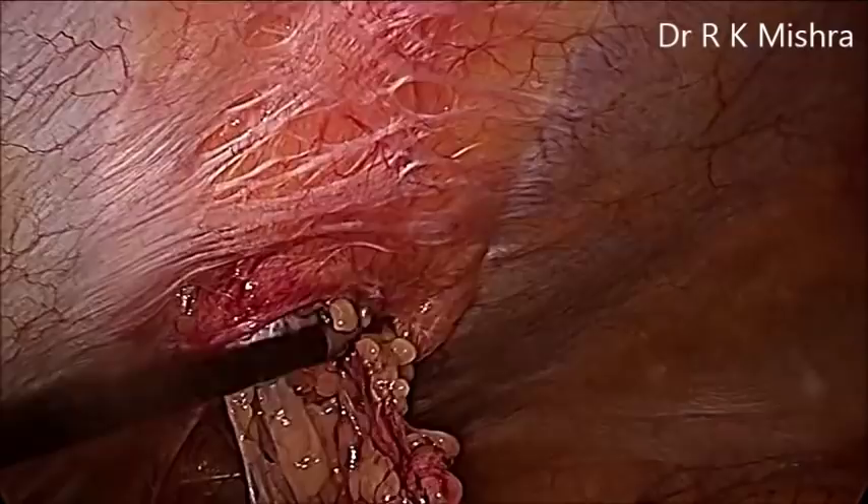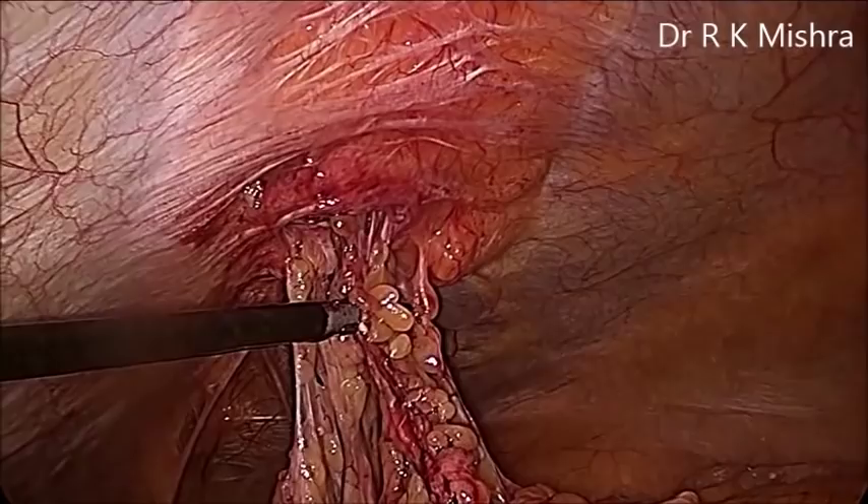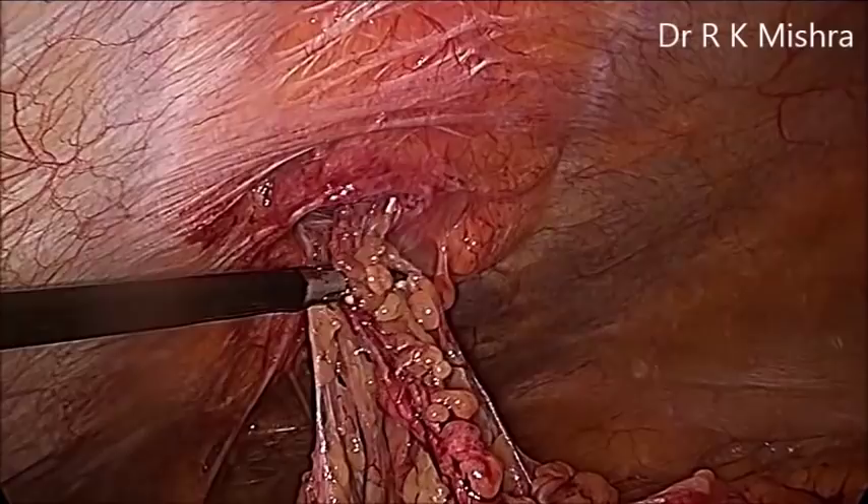This is the slow dissection and slowly the entire sac is separated. Sometimes it is so adhered that it will not come easily. In those situations, either you can use bipolar with scissors or you can use harmonic to separate it.